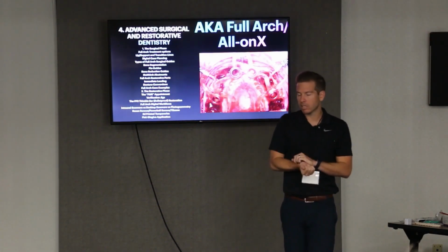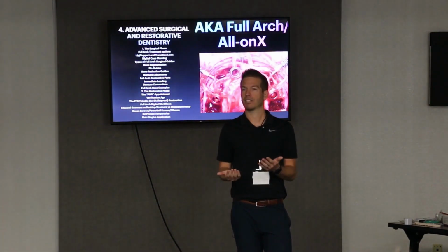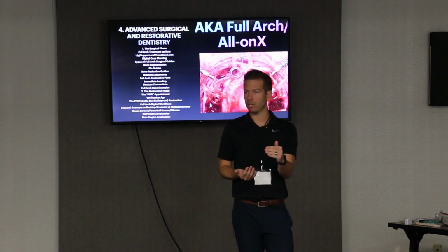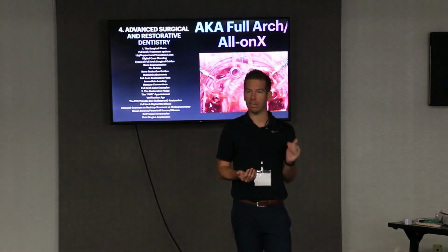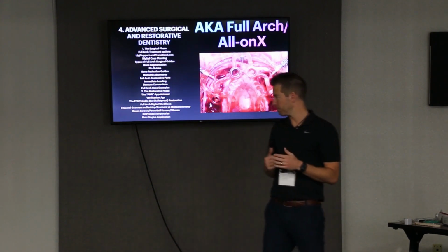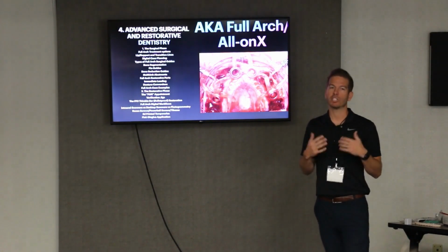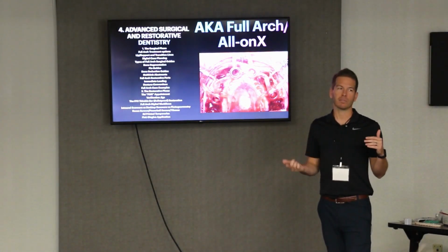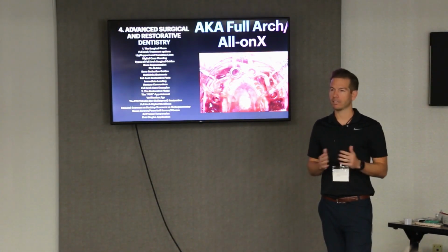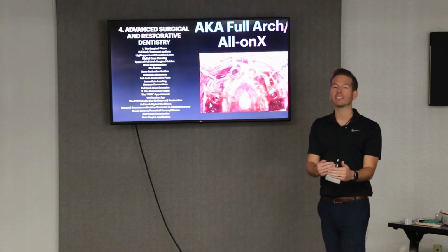Because we talk about this a lot, patients don't want implants, they want teeth. And those teeth are what drive the case. Where the teeth are going to be, that's what the patient wants at the end of the day. They don't want screws, they want teeth. So we've got to put those implants where they need to be to support the teeth. We talked about this before, but it's all about the wax up. It's all about where we want the teeth, and then we build the case to fit in that mold.